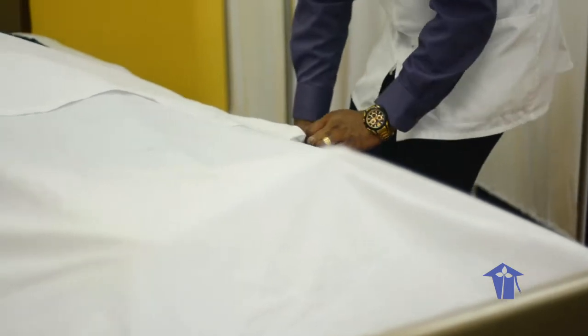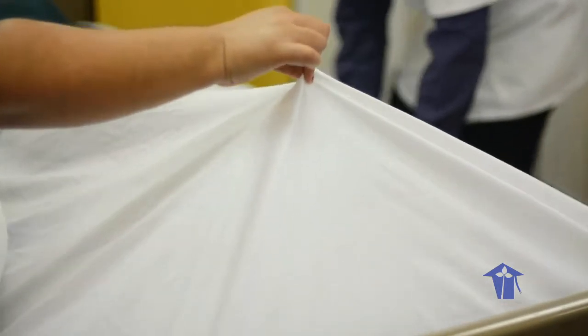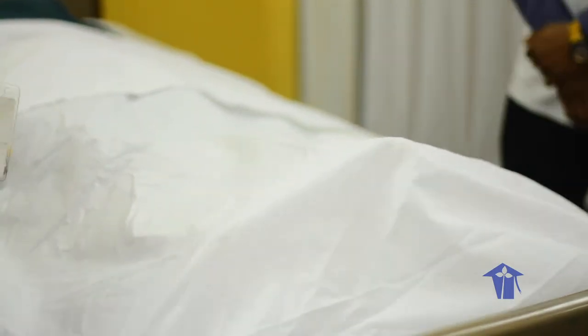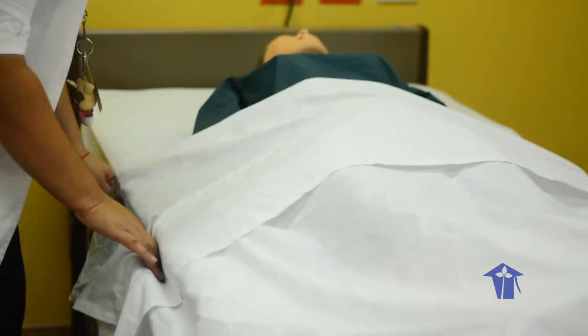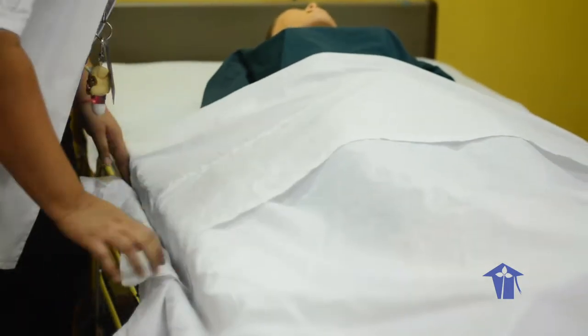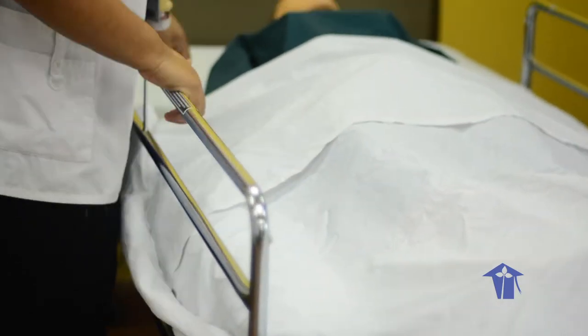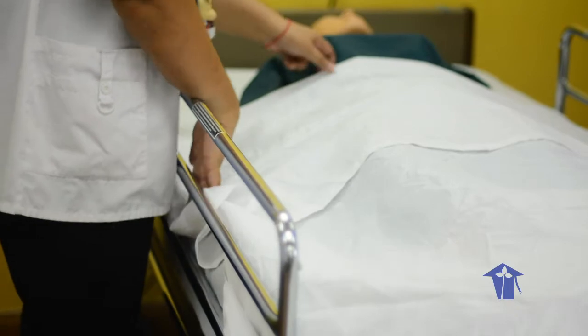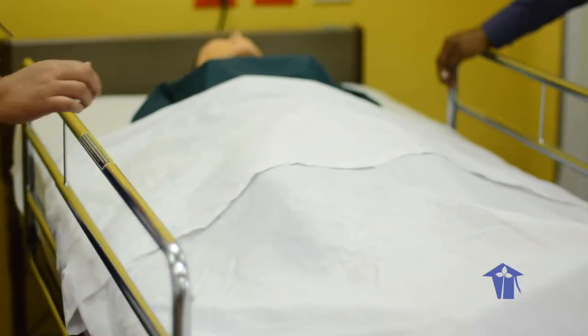Alright? Now for the sheet not to be too tight, we are going to pull it a little bit, so the patient will get a bit of foot room. Because you don't want it tight on the patient, alright? And then you will put up your side rails on the patient. Are you okay, Mrs. Jane? Yes, I am. Good. Are you comfortable? I'm comfortable. Right. So this is an occupied bed, alright?